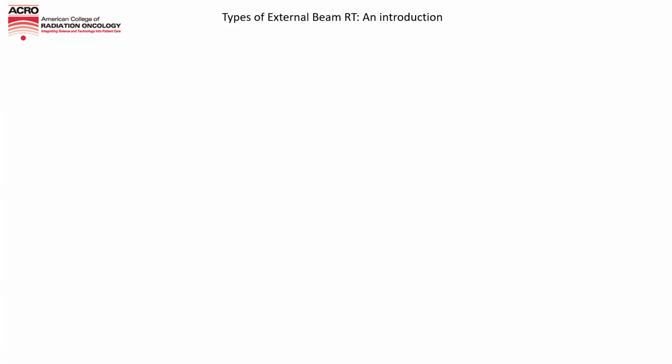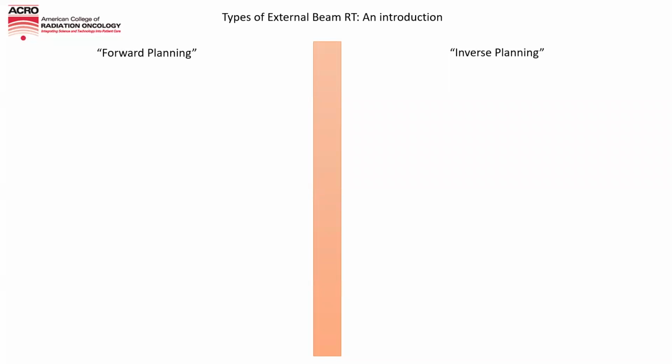The goal of this video is to explain some of the most commonly used types of external beam radiation and the many acronyms that go along with them. To start, we'll break radiation treatments into those that are forward planned versus those that are inverse planned.